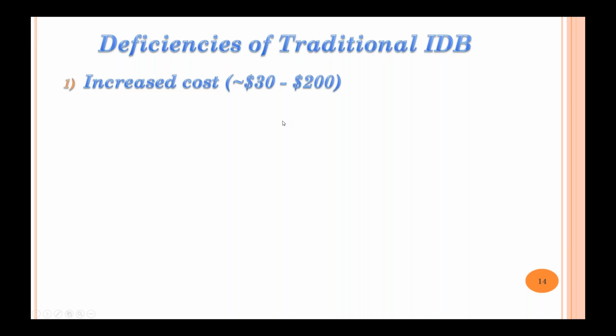So that was very cost effective, but there's still doctor time involved in that. Traditional labs are typically somewhere in the range of $200. They have different ways of billing, but I'm just saying it's around $200 for traditional indirect bonding trays.